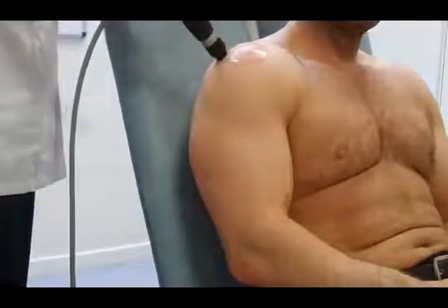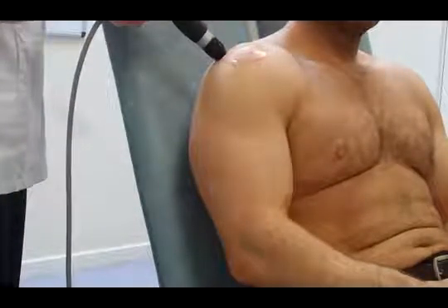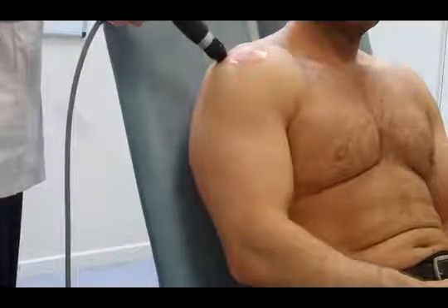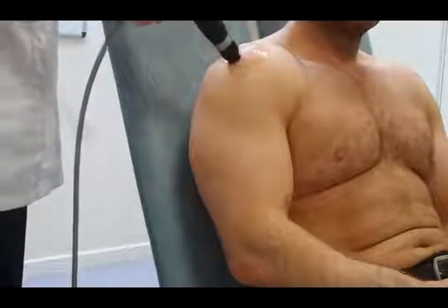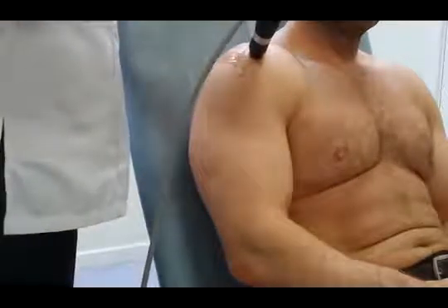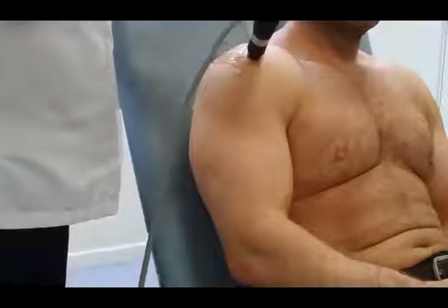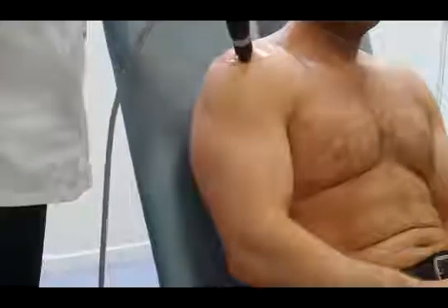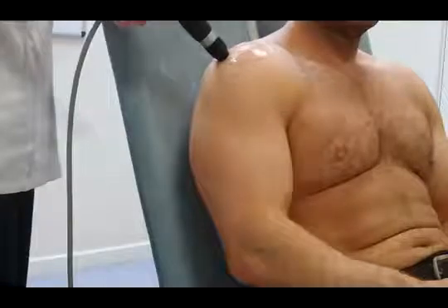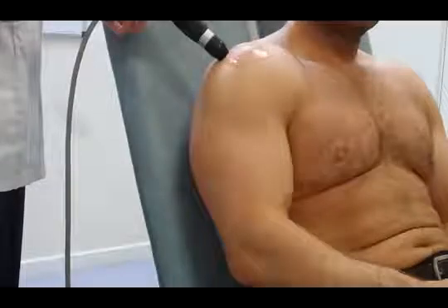You might find that if you do more than 200 shocks, the patient just may not be able to tolerate the pain. If that's the case, move off the area and come back again and do another 200 shocks on the area. And just keep working backwards and forwards across the tendon until the 2000 shocks are reached.